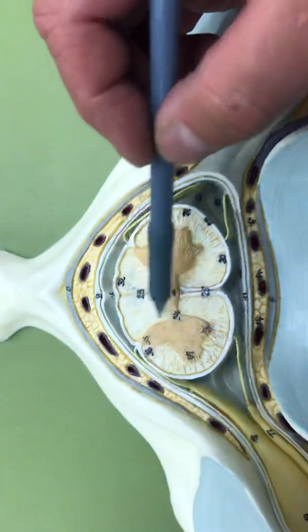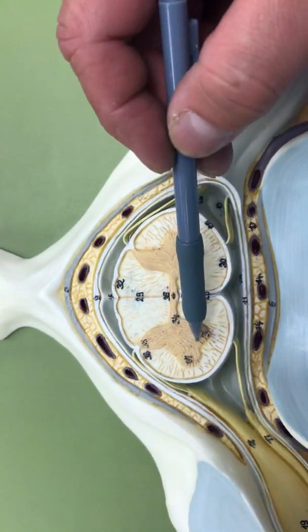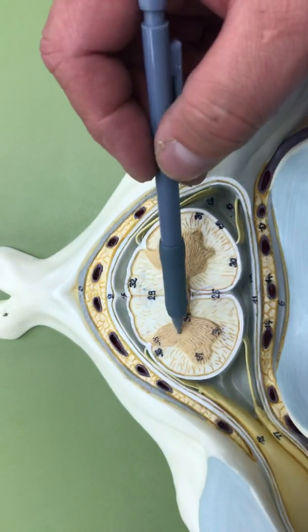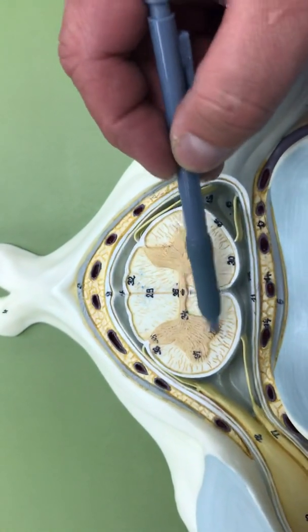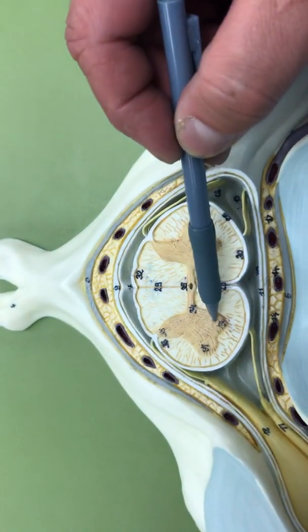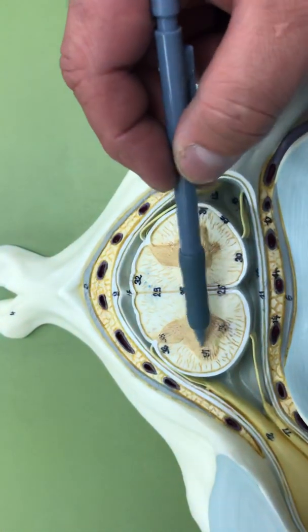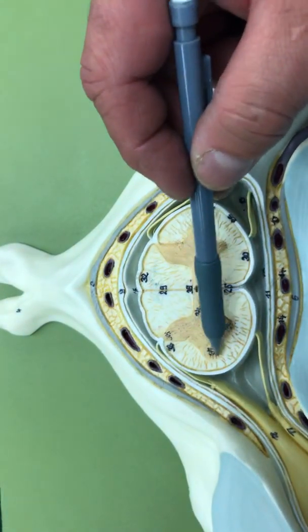Now, you do have horns here, which consist of cell bodies and unmyelinated axons. The cell bodies on the anterior horn carry motor signals. So on the anterior or ventral horn, you'll see cell bodies for what we call our lower motor neurons. Then you'll have the lateral horn. They're carrying sympathetic messages, right? So this is our lateral horn.